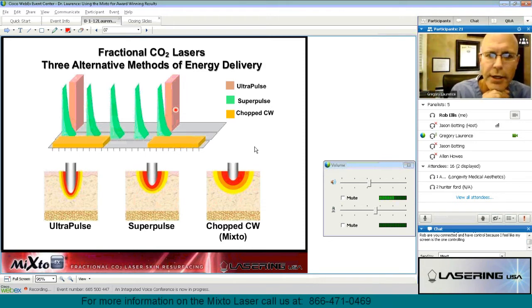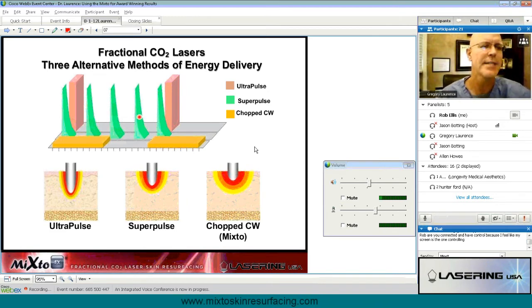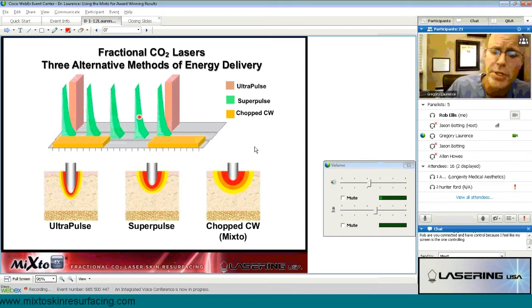And what you'll appreciate is although they look a little bit worked over, they don't have that look that patients had that were treated with ultra pulse or super pulse resurfacing technology. Those technologies have no coagulation, and because of that, they really have blood running down their face, and they just don't present very well to their family members or to themselves, and from a marketing standpoint, it's really difficult.